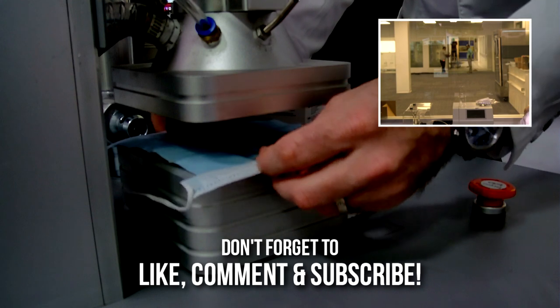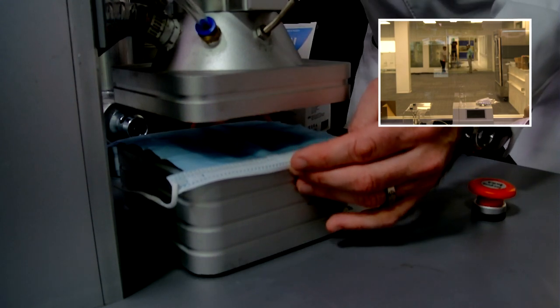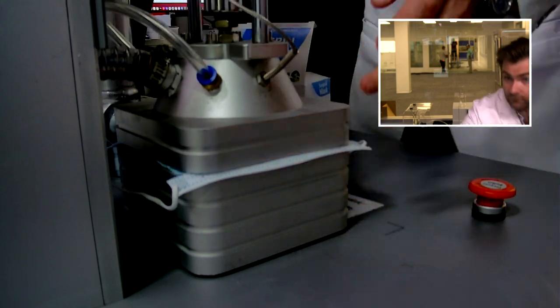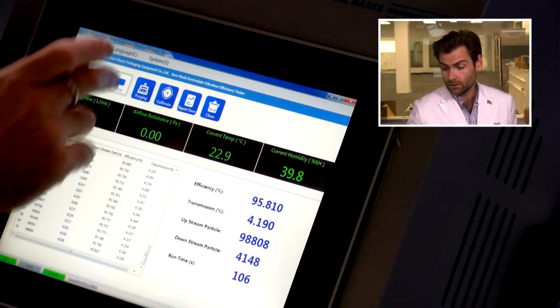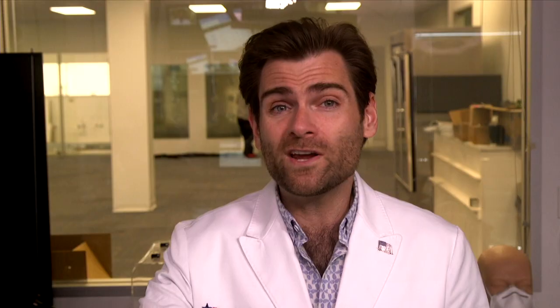Let's open this up and get it in the chamber. You can tell I don't love the spunbond quality of this — I'll talk about that in a second. Get it clamped good first. Let's let it rip. This is a PFE machine — particulate filtration efficiency machine.